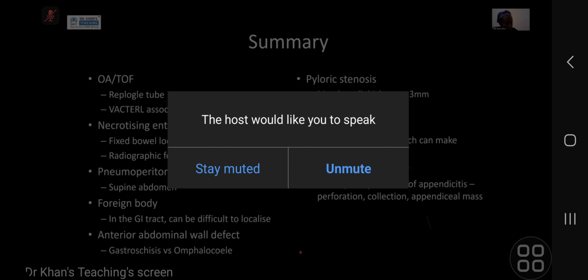And then they'll go on to have renal ultrasound to look for the renal malformations, and the anorectal malformations should be diagnosed clinically. We've talked about necrotizing enterocolitis, so we're looking for non-specific signs on radiographs, which include dilated thick-walled bowel loops, or non-changing bowel gas patterns, or distended bowel loops, as well as more specific signs, which are pneumatosis intestinalis, portal venous gas on the plain film, and pneumoperitoneum. And also the importance of the use of ultrasound in necrotizing enterocolitis, primarily for follow-up rather than diagnostic imaging, and it having similar features as we see on the radiograph.